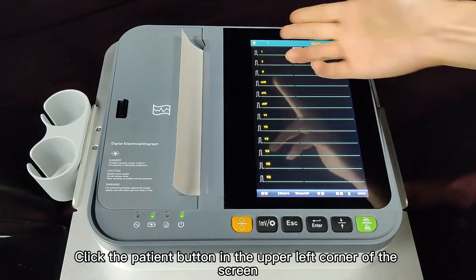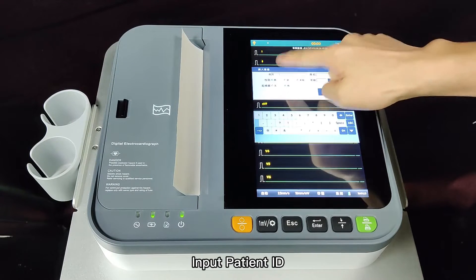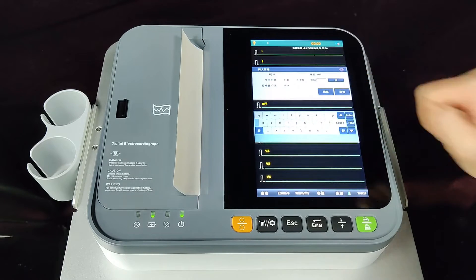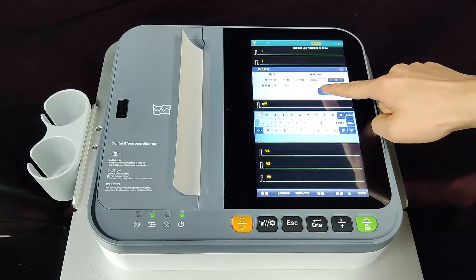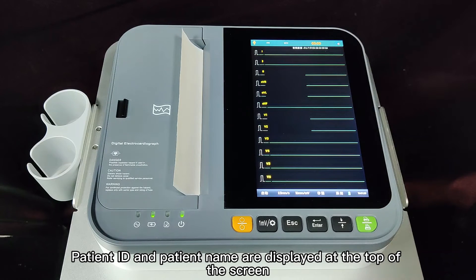For clinical use, click the patient button in the upper left corner of the screen. Input the patient ID, name, gender, whether the patient has a pacemaker or not, and age. Set complete. Patient info input is done. Patient ID and patient name are displayed at the top of the screen.